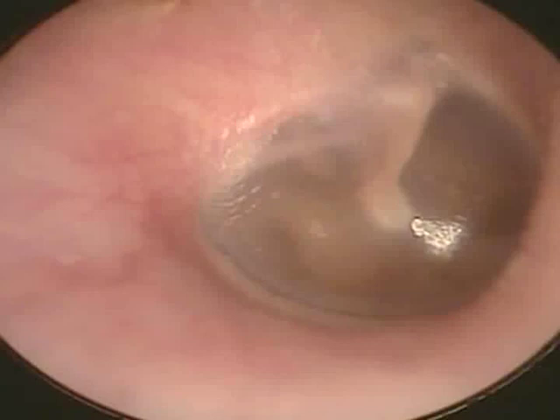So the malleus bone, which is attached from the inside of the tympanic membrane in the middle, has got sections. It is the handle of malleus and the short process of malleus, that you must be able to see through the otoscope. It must be visible. The handle of malleus and the short process of malleus, which comes out on the tympanic membrane like a tip. Okay.